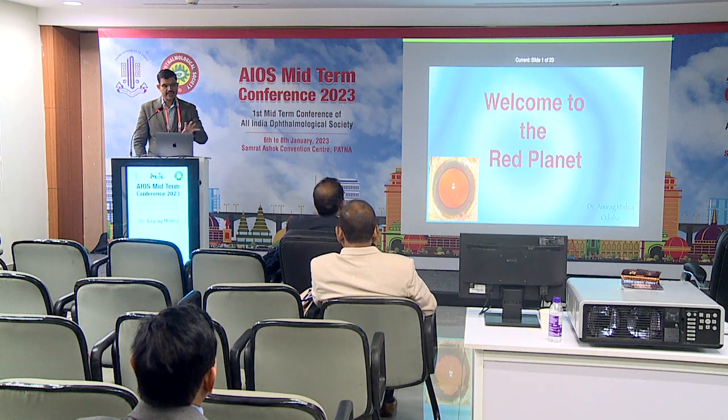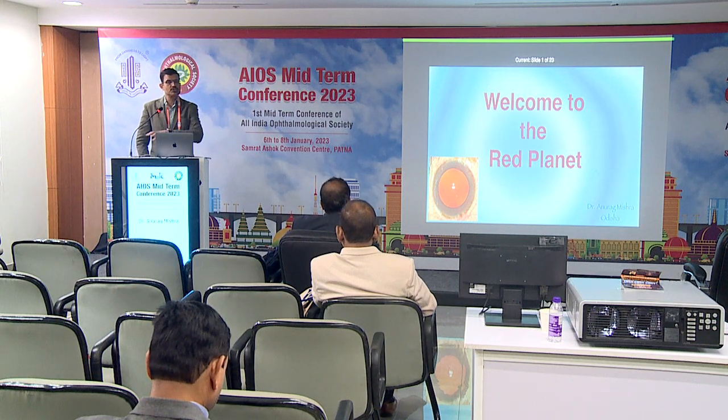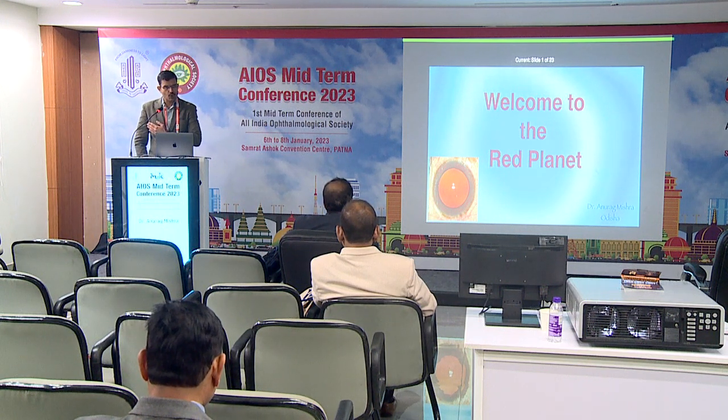The red glow stays for a very long while, and it has a huge margin, so it doesn't shift or go away with the moving of the head of the microscope. So it's not a sweet spot where the red glow appears. It appears all throughout your surgical field practically, as we'll see later on.